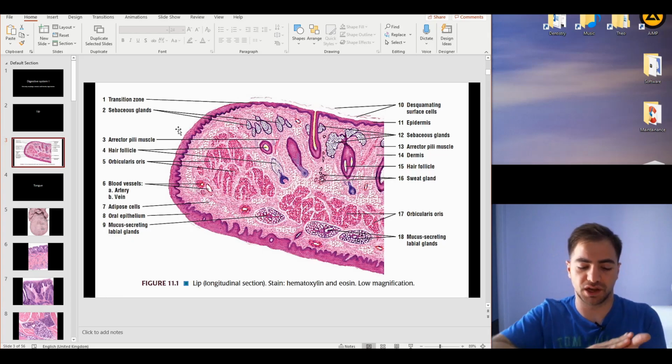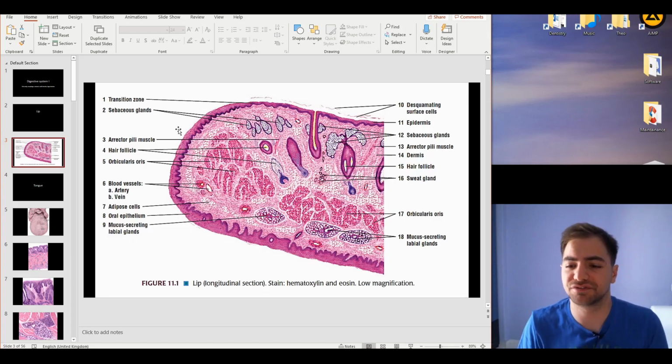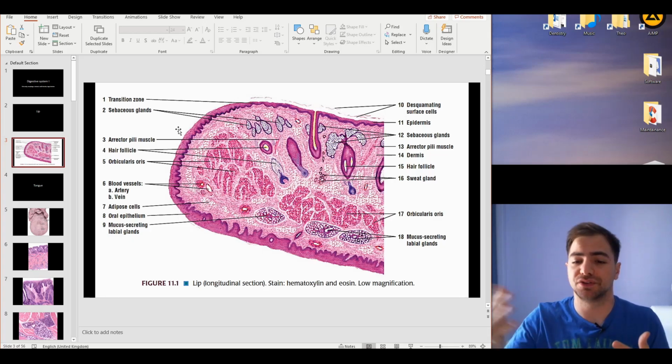This is again in the upper part of the epithelium. The epithelium itself has no color. Then there is no color, and the only thing that actually can reflect the color of the vessels, and this is exactly why our lips are red to pink. Now, in the posterior border of the lip, we can actually find the oral mucosa.